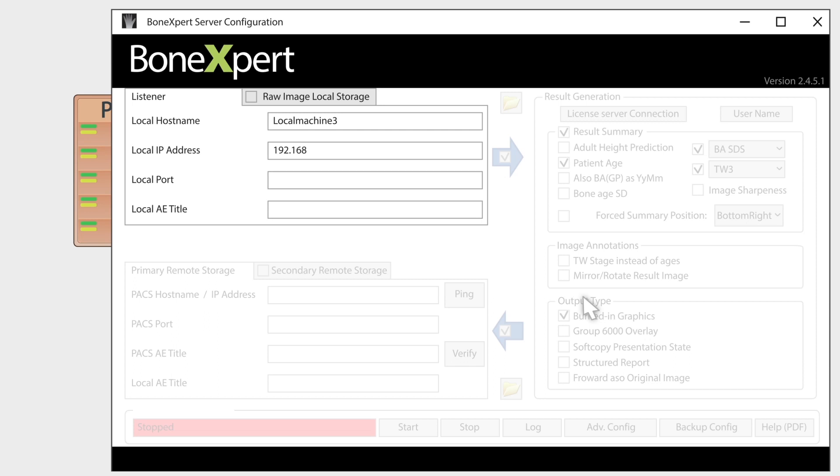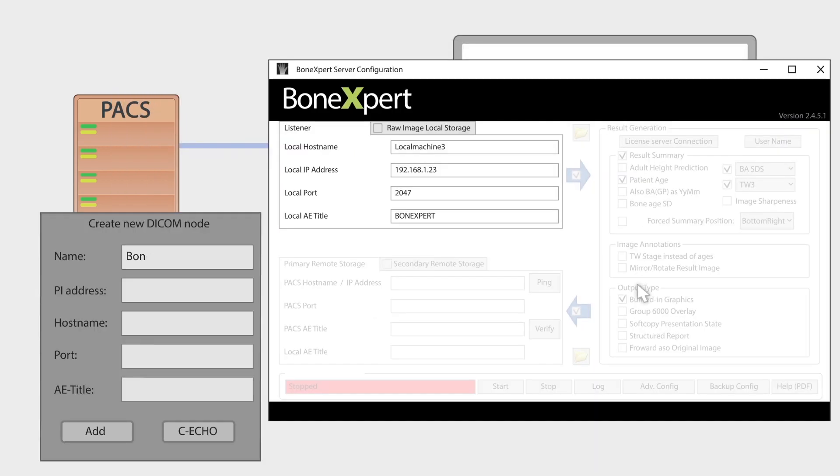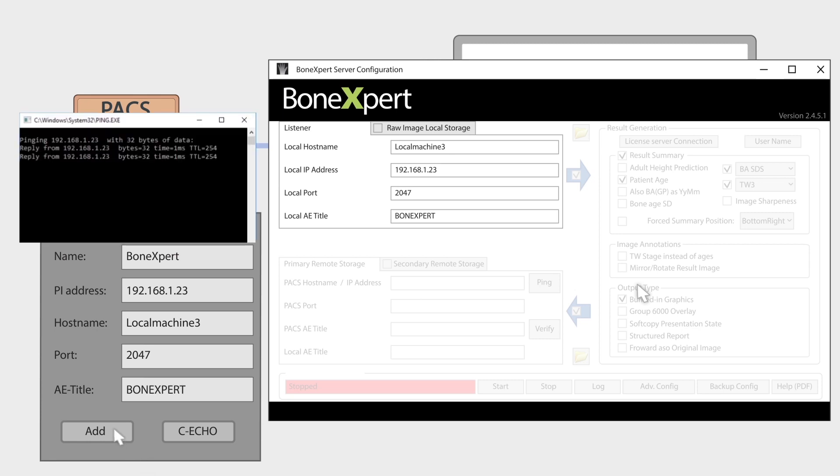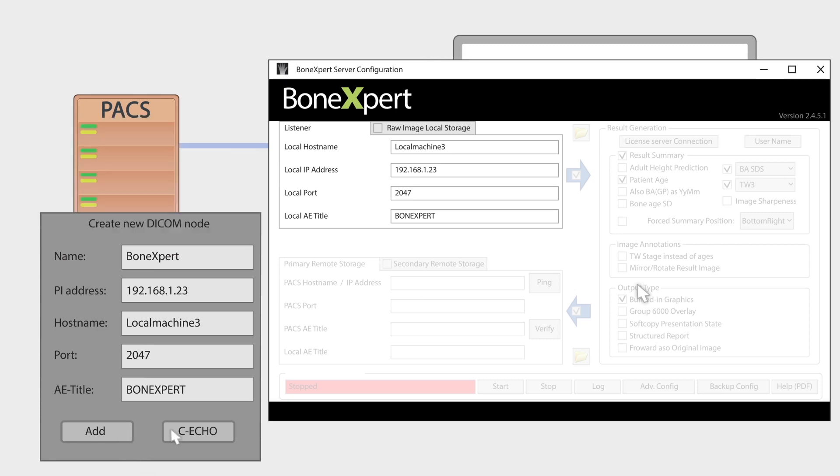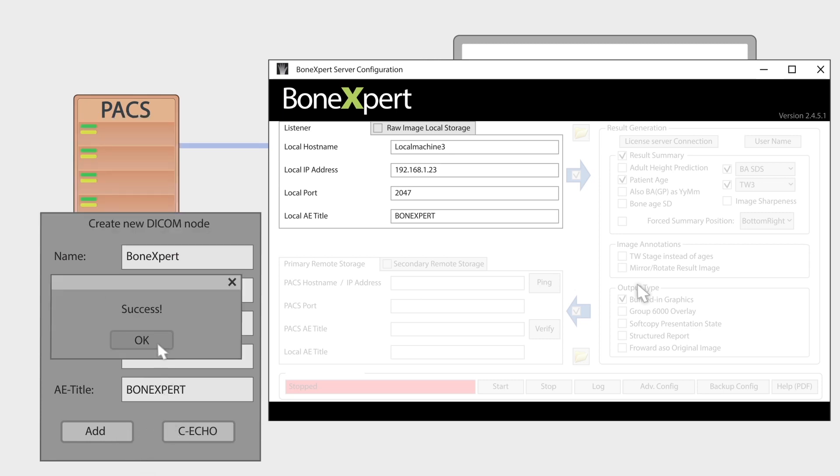In this pane, you define your new BoneXpert DICOM node. Next, go to your PACS and add the node. Verify the connection from PACS with a ping and a C-echo.